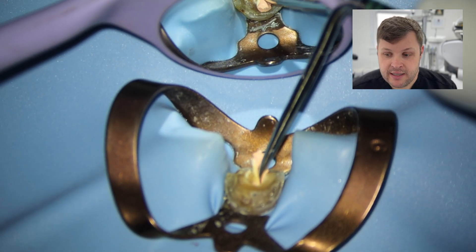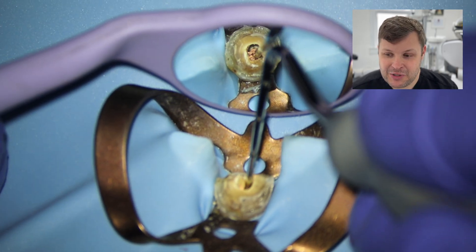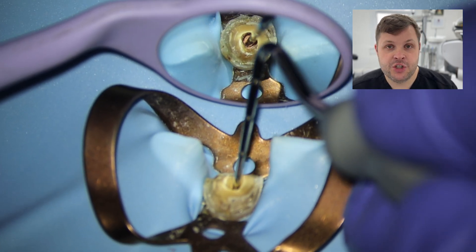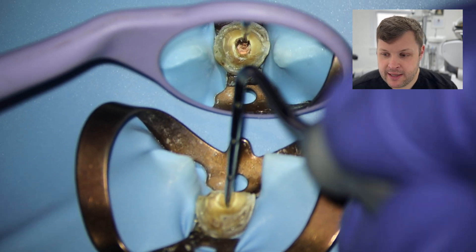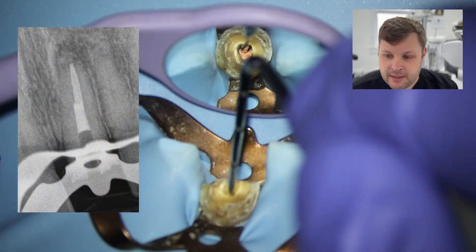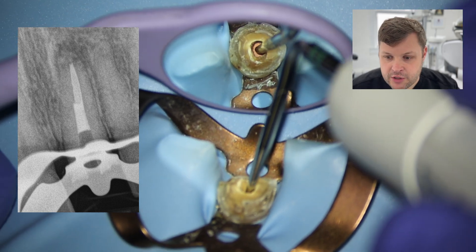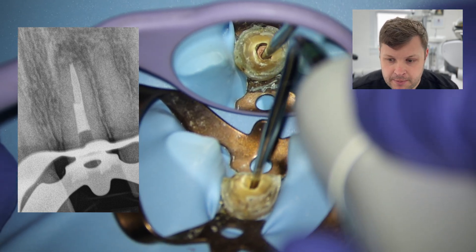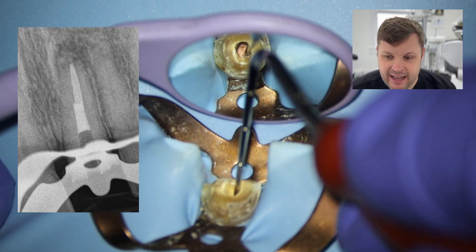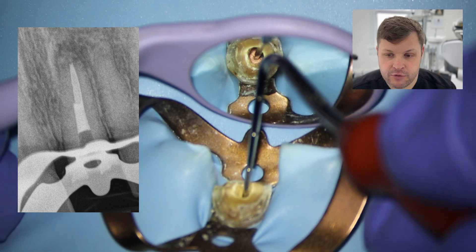I'm going to burn off the excess and create a nice apical plug. I'm not gung-ho here — I'm very worried about extrusion even though I've apically gauged the tooth. I've probably burned just the coronal third of the GP and when I push it down I've only compacted the coronal to mid-third. You can see the obturation is not adequate — there are obvious voids in the mid to apical third.